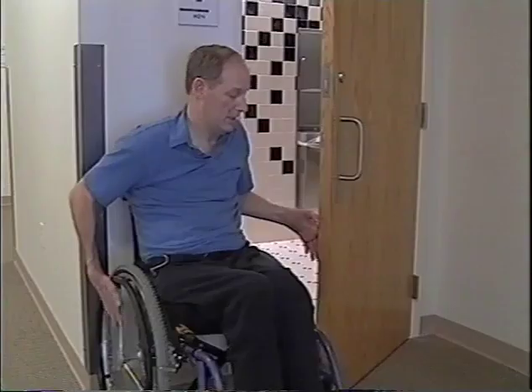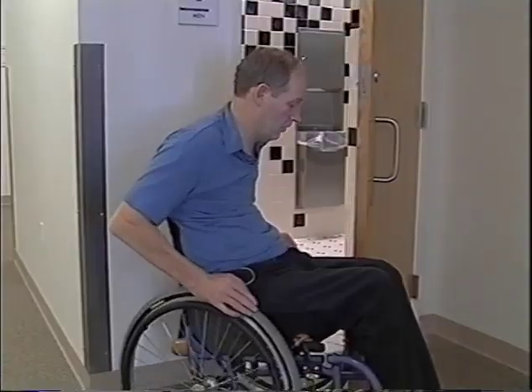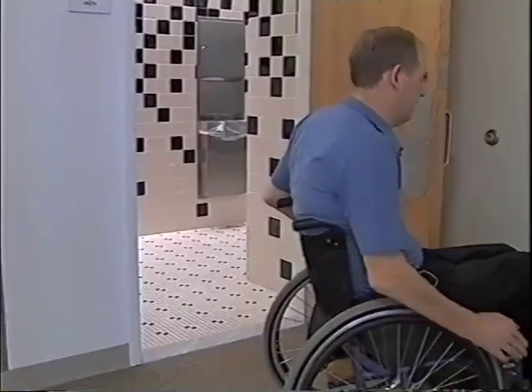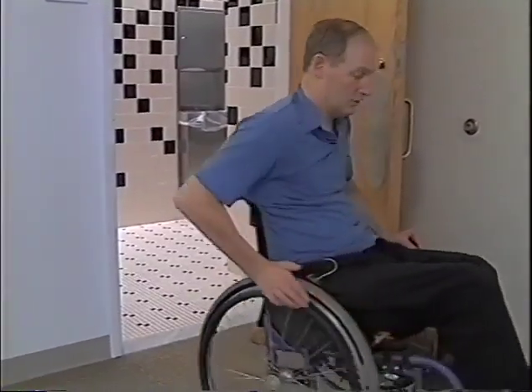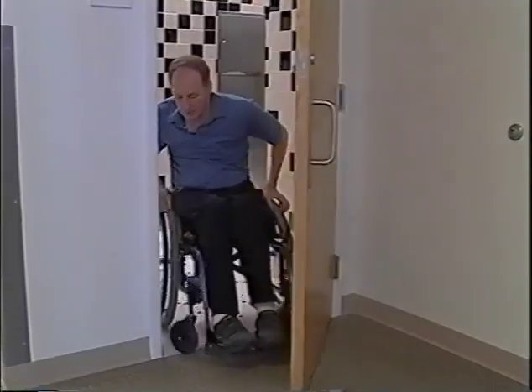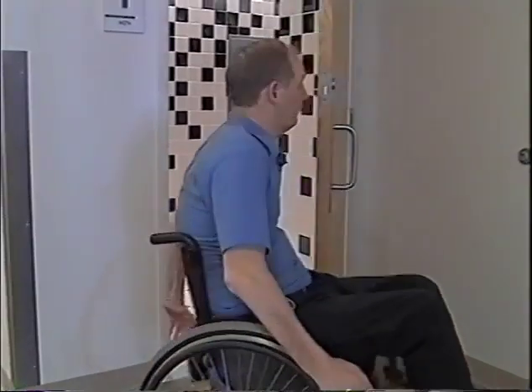That's okay if you have triceps. If you don't have the triceps, then a technique you might want to use is to get the door open and turn your chair into the door enough to get your wheels on the door, and then push the door open. And once you get to about this point, you just want to try to turn yourself and roll backwards and push yourself through. Okay? Now, I should mention here that this door is extremely accessible.